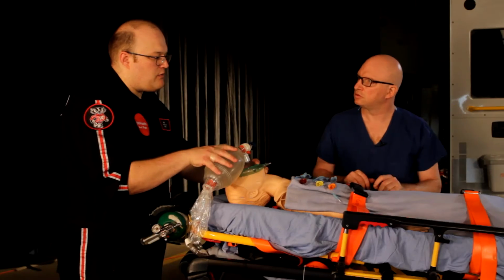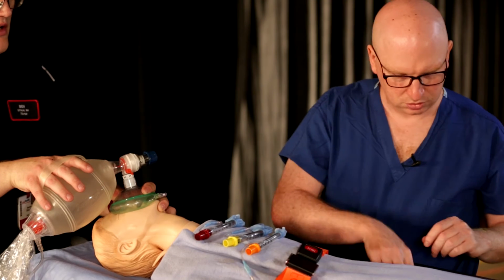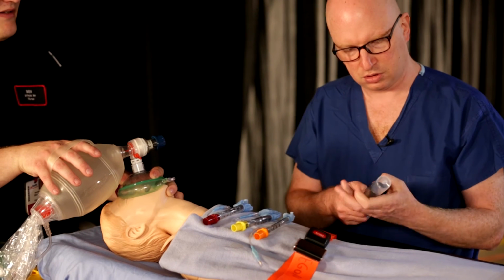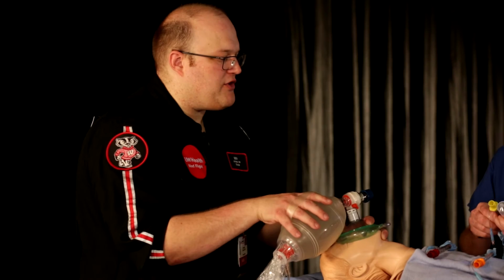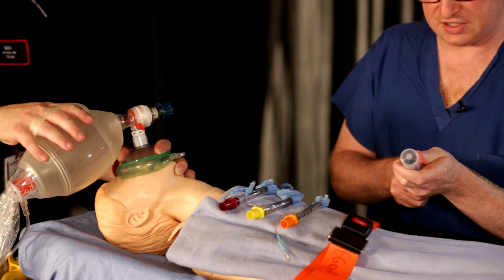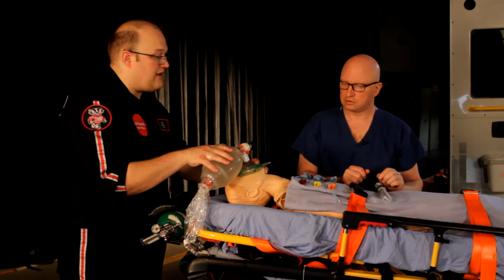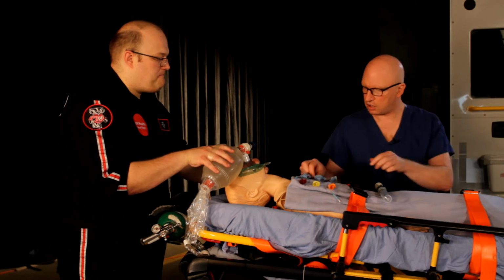Okay. So what we're going to do then is make sure we have all of our equipment. So Jonathan, can we make sure we have a syringe? It's going to be at least 50 to 60 cc's. And if you check the tube, it'll tell me how much air I should be putting in the tube. All right, this says 45 to 60. I'm going to give you 60. Okay. And then we're going to look for lubrication if we can, so it makes it easier. Okay, I think these are all lubed up.